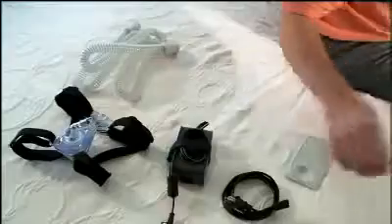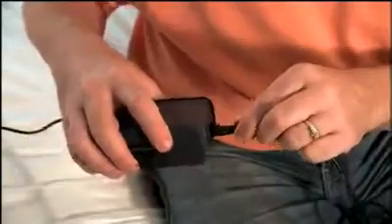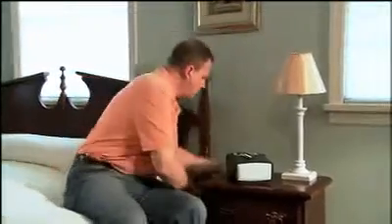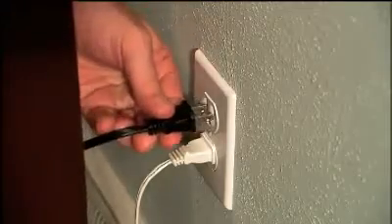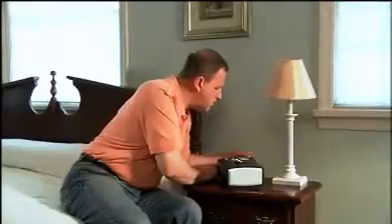To activate both the System One device and the humidifier, plug the socket end of the AC power cord into the power supply. Plug the power supply cord connector into the power inlet on the back of the device. Plug the pronged end into an electrical outlet. Don't use an outlet that's controlled by a wall switch. The device should now have power.